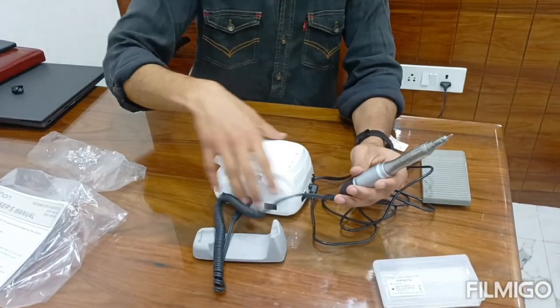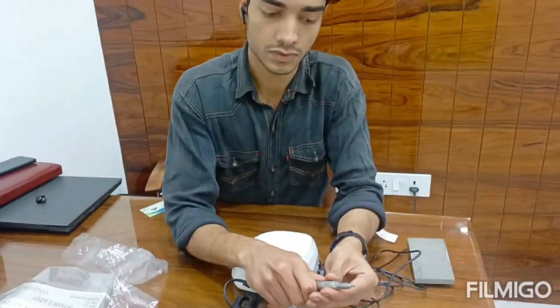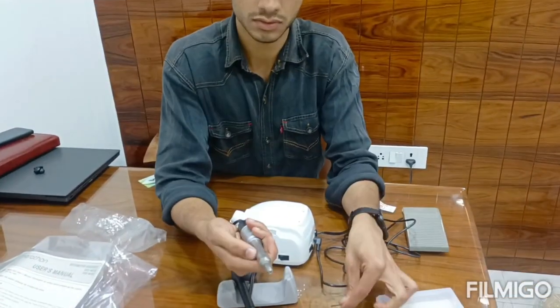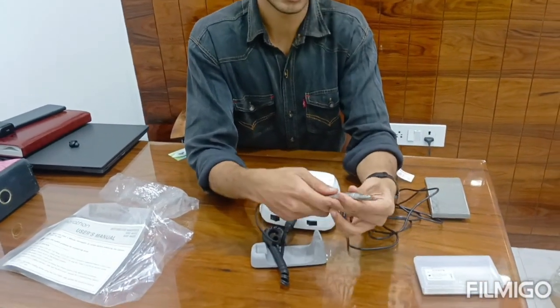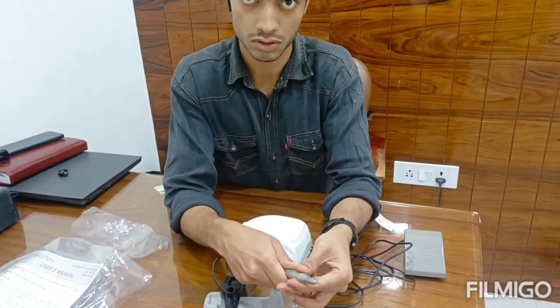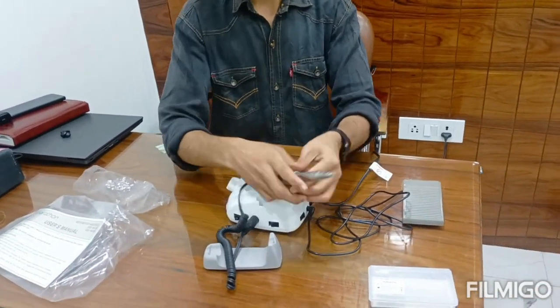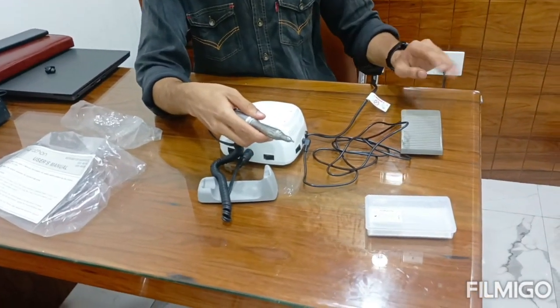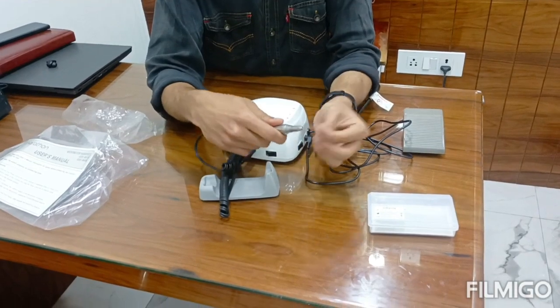And if you want, you can remove the hand piece like this. Unlock and lock. You can unlock and lock the hand piece to attach or detach it.